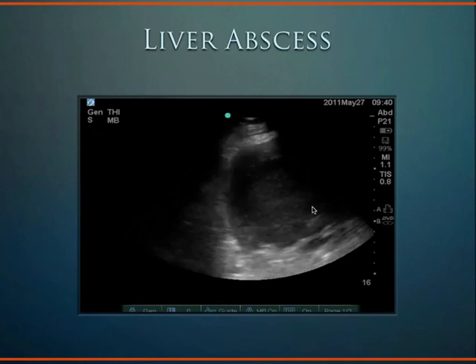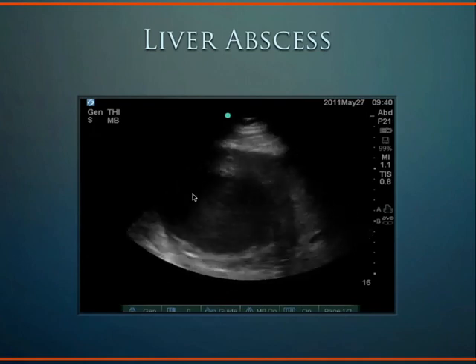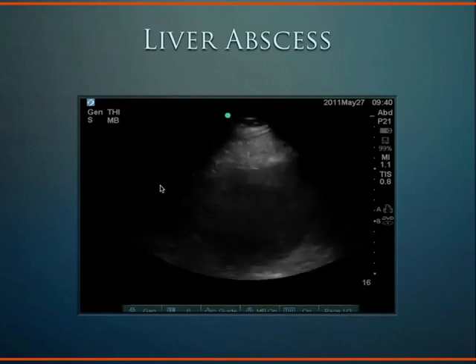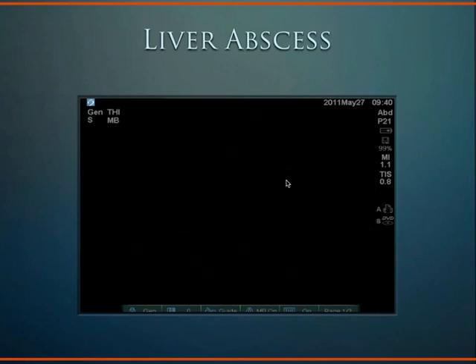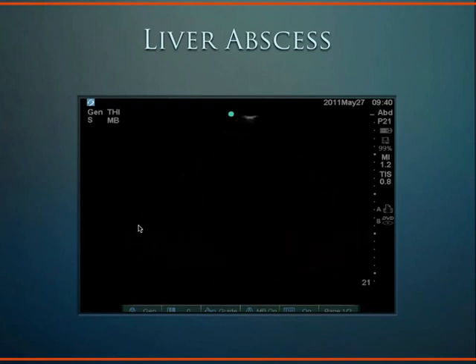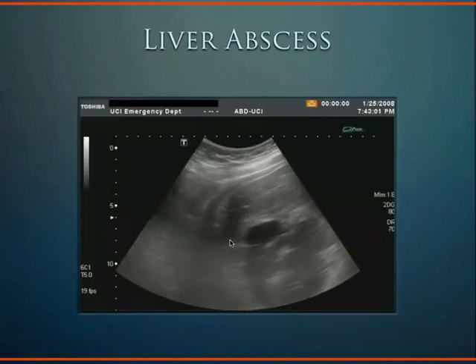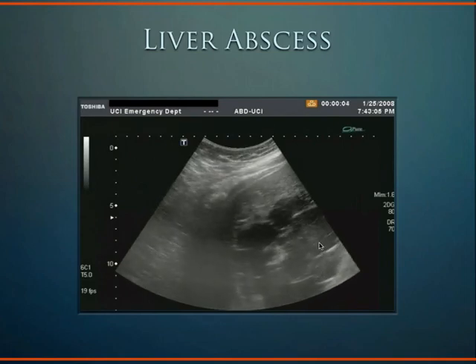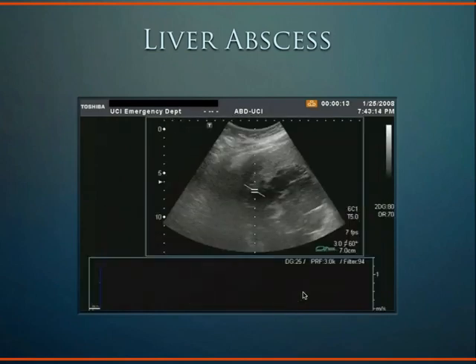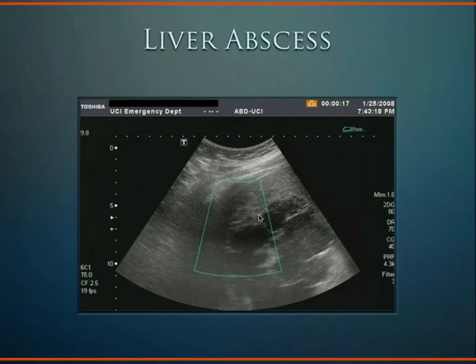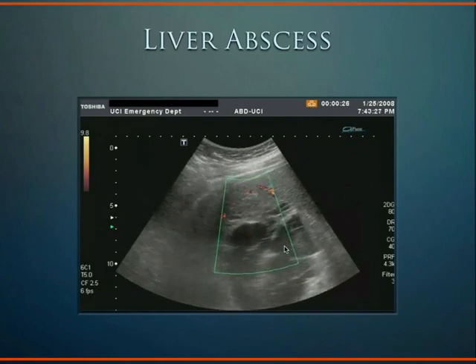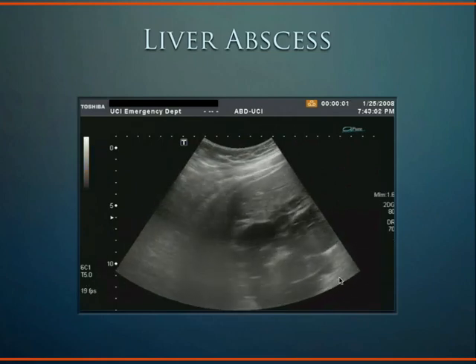The rest of the liver — we can see abscesses in there as well. This is a liver abscess. This is the liver seen here with this hypoechoic encapsulated structure as an abscess within the patient's liver. Echinococcus or amoebic abscesses are somewhat common in our patients at UCI. We can see this as a distinct structure within the liver encapsulating itself. Here's another example of an abscess with various regions or loculations — and this is normal liver tissue here. I tried to put flow on it to see if it was a vascular aneurysmal structure; it does not really light up with flow. The flow is seen in the periphery in the liver, and it's mostly the 2D grayscale findings that confirm this is an abscess.